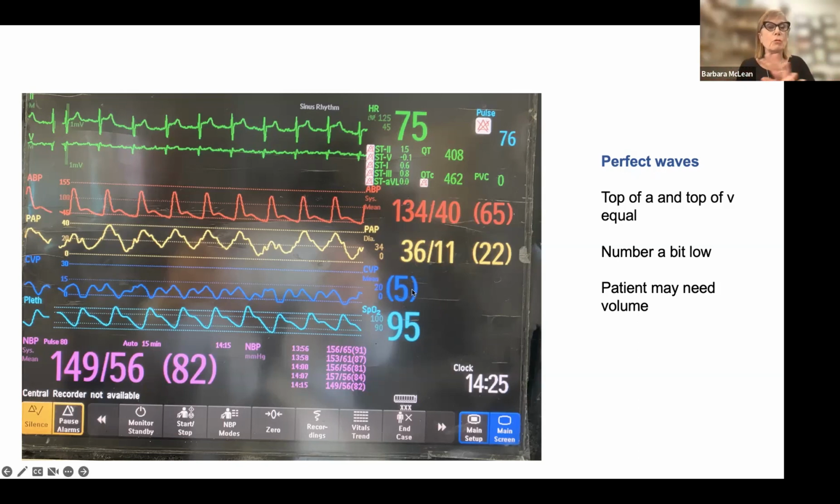Of course, I always want to be sure my equipment is right. I'm leveled, I don't have any air bubbles. I'm pumped to 300 millimeters, not more, not less. 300 millimeters in my pressure bag, which maintains the constant opening of my transducer and the constant flow of volume at 3 cc's an hour into the patient. Now I'm looking at this visual, and I'm going to say, here's my P wave. It's not a very good picture of a P wave.